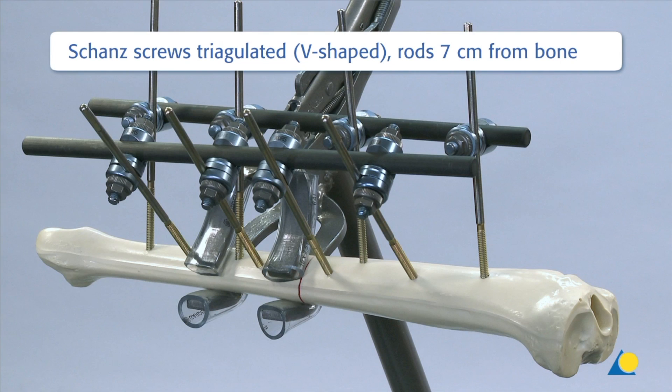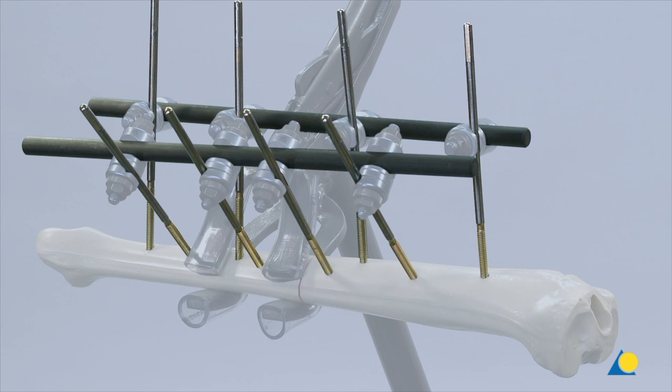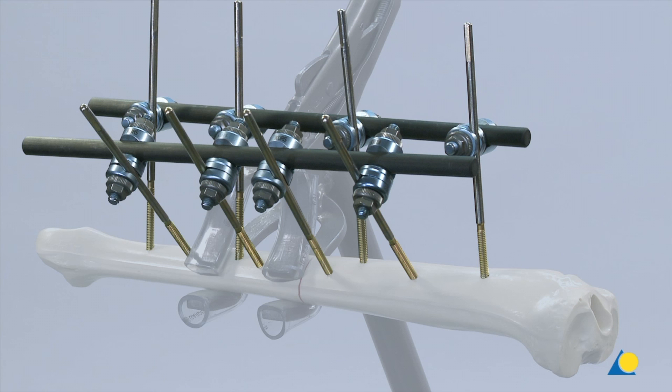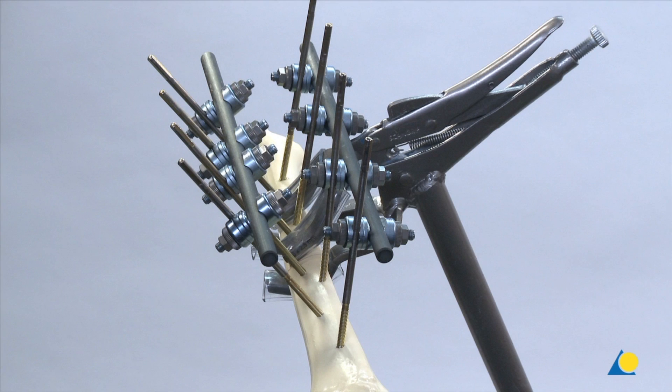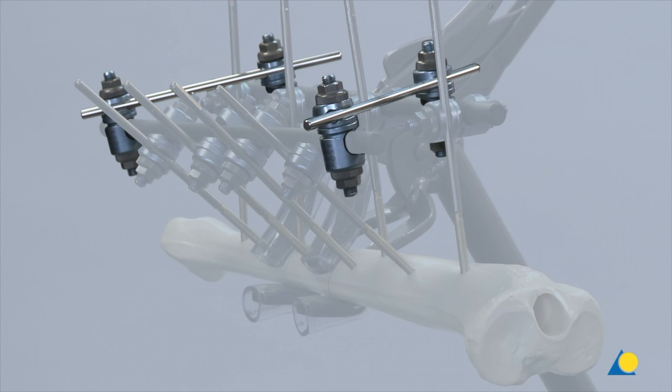In this triangulated construction, the Schanz screws are placed in a V-shape. The rods are placed 7 cm from the bone, and each rod is secured with four large open self-holding clamps. Extra stability is provided by mounting two connecting bars, each secured with two large open self-holding clamps.